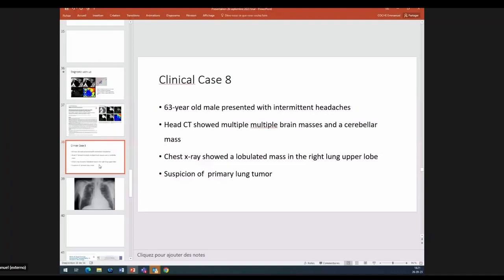If you have high density, you don't know if it's iodine or calcium, you go to virtual non-contrast. We asked chest radiologists if they are playing with dual energy CT, and most of them are not playing with dual energy CT because it's not a friendly user interface.